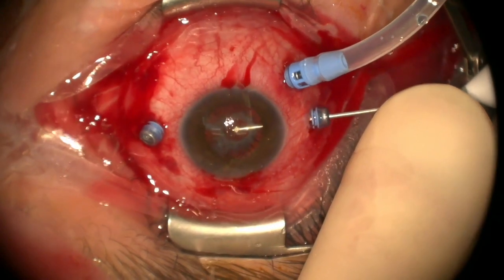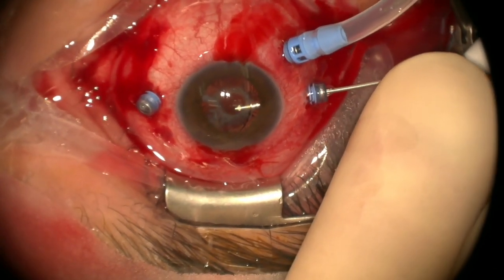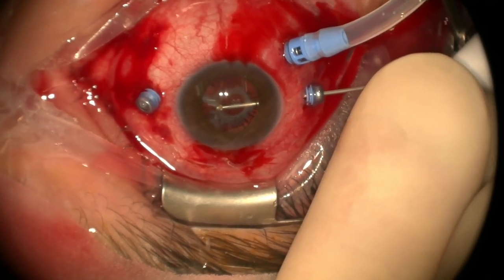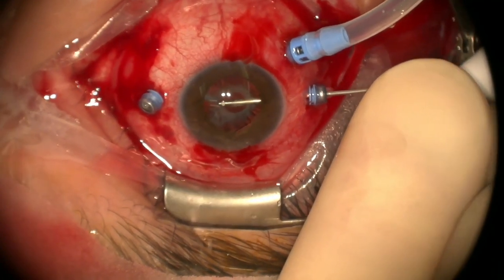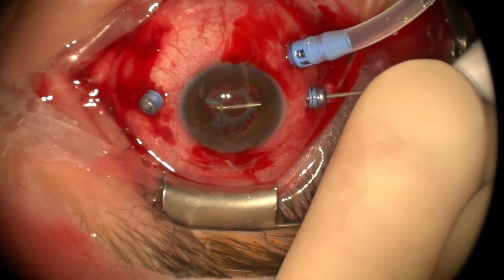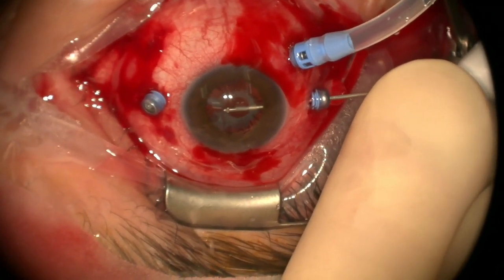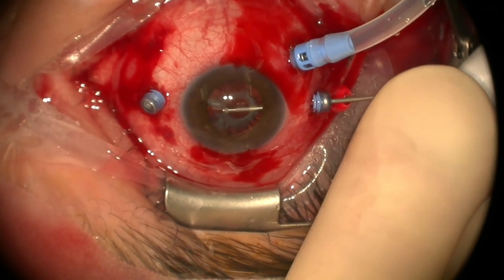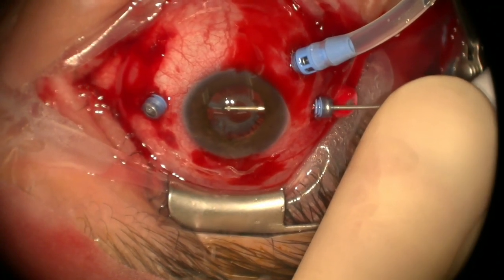Let's put the cutter on, there you go. And so this is our anterior cap. So we're gonna try and cut into that. And it's very thick, but we'll get it one way or another. You want me to take the cut right down? I thought about that, I don't think so. I think we'll be fine. There we go, now we got an edge.